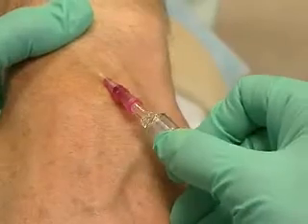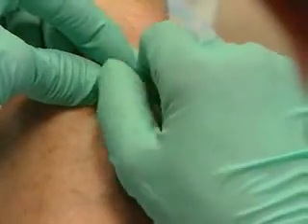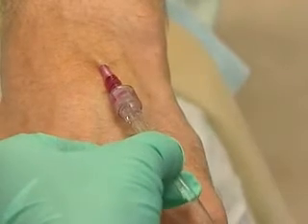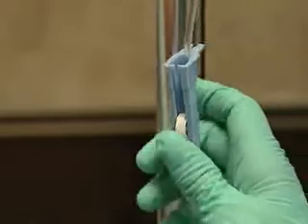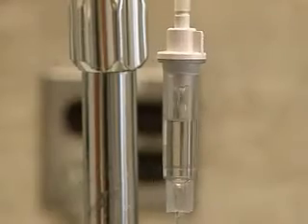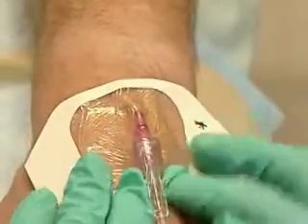You apply a little pressure to the puncture site to control any bleed back before attaching the line. The distal end of the tubing screws firmly into place. Hold the catheter in place while you check the tubing to ensure flow. And protect the insertion site.